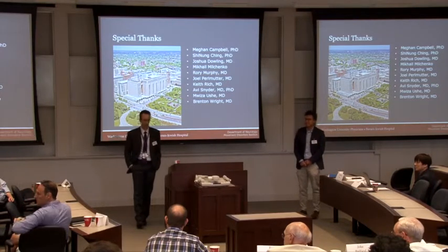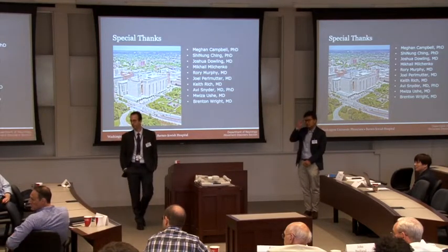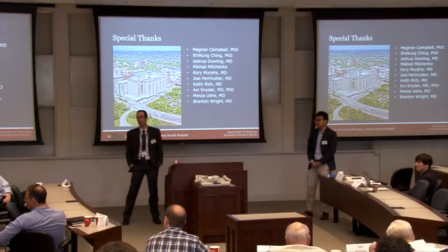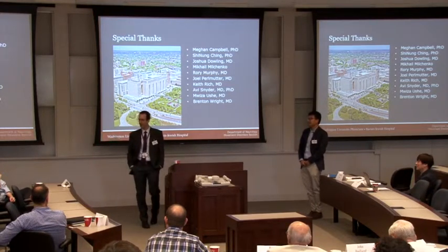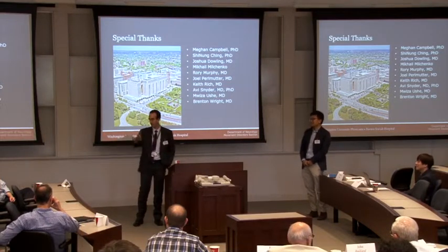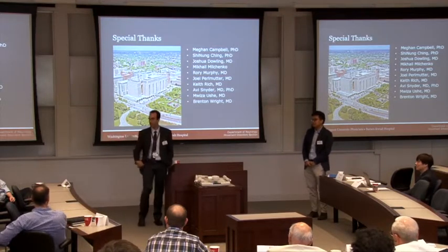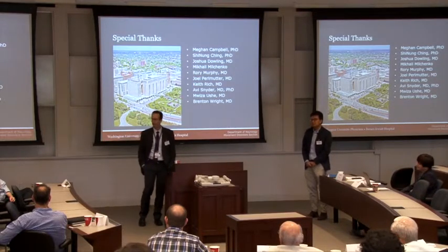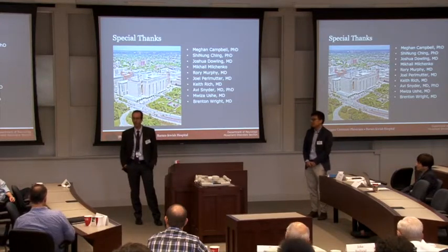Quick follow-up. Do you envision giving the patients an opportunity to tweak their own parameters? As I understand, that sounds attractive to engineers, but maybe not so much to patients. So we run into problems when we allow patients to tweak devices, giving them an A option and a B option. They switch back and forth, and then there are those delayed effects that we have no way of measuring. Now, with wearable technologies, perhaps we'll be able to collaborate and obtain more data and synthesize that data outside of the patient's subjective experience. Now, is that important? I don't know.